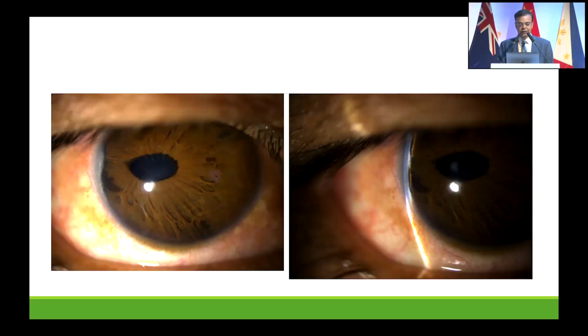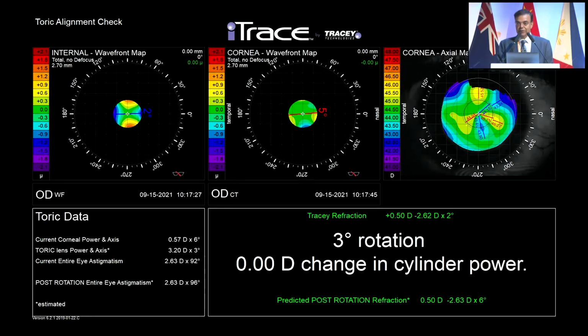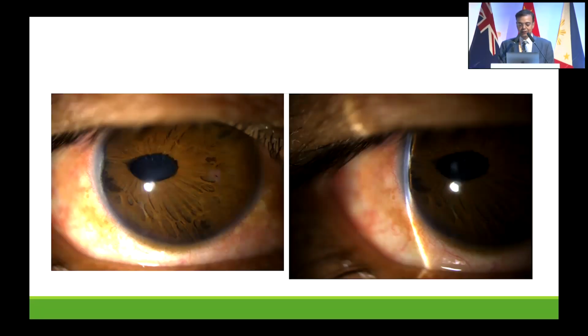Patient did quite well. So this was a gratifying surgery, and of course these implants have that possibility of leaching pigment, but we've had a few of our patients over the last 10-15 years. We've not really seen a huge degradation in the quality of these implants, and they can be customized by one of the companies that we work with in India. So this was another patient.